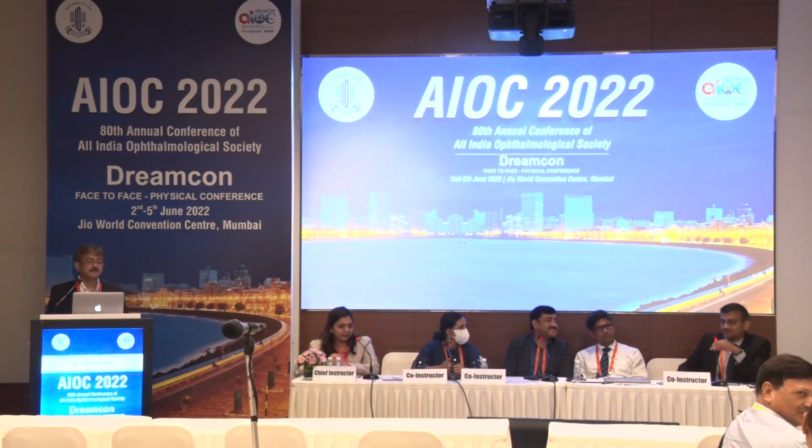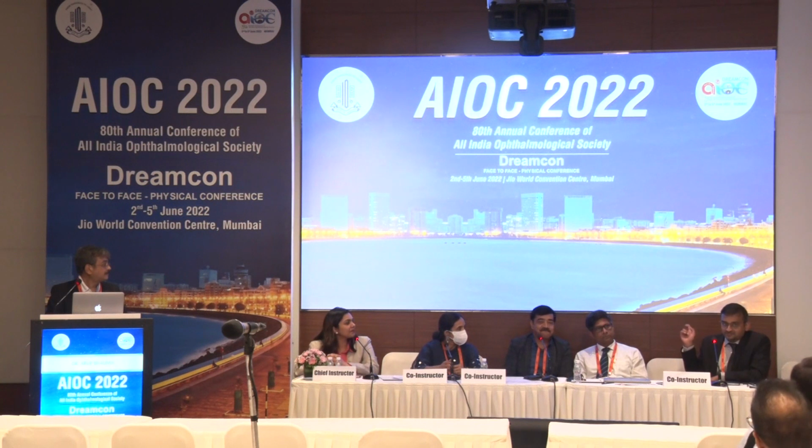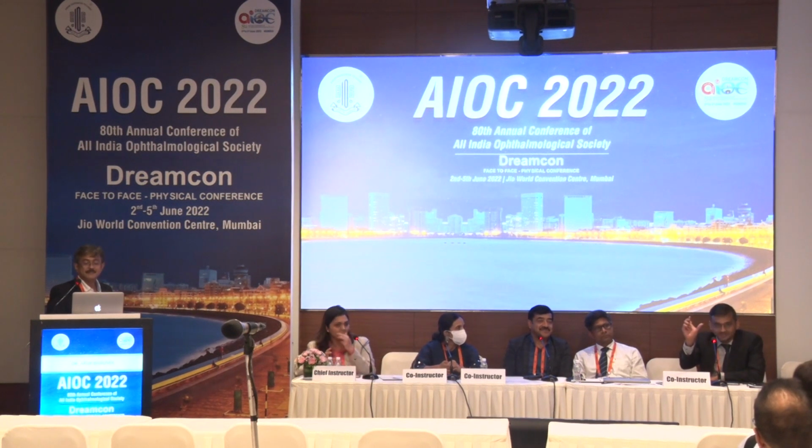Dr. Arupa has completely covered everything, but the best part about that astigmatism fix calculator is that it gives you a curve. It tells you where exactly you want the cylinder to be. So you may not correct it to plano, but it will bring you to the least possible astigmatism. You can play around with that. It is an excellent, wonderful software, and it is free of cost.